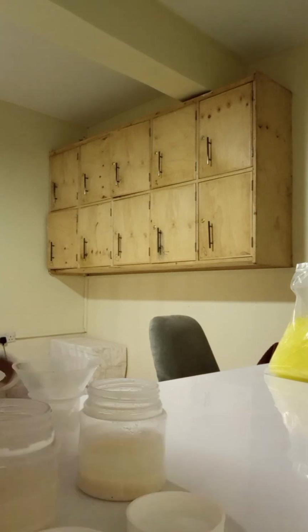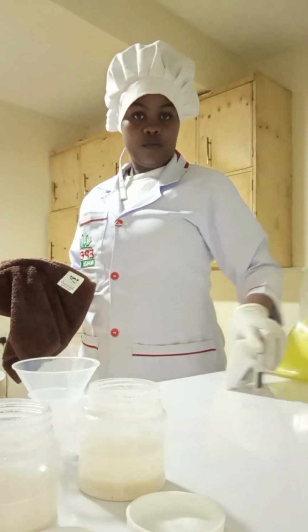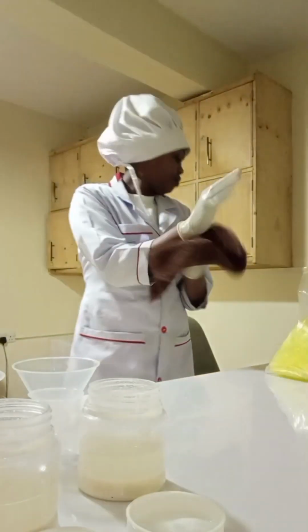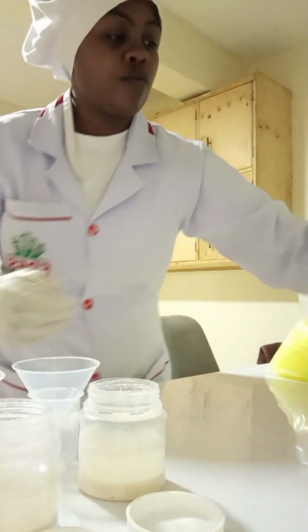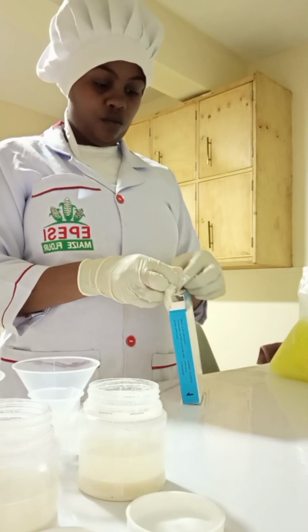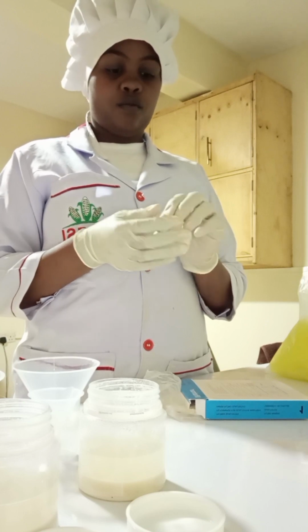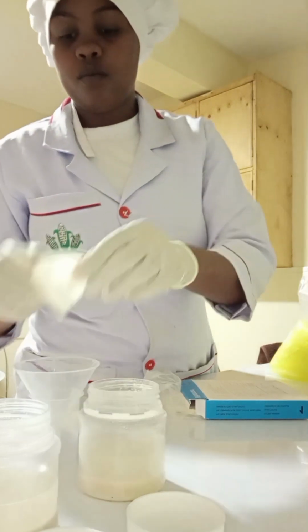You take the filtrate. The filtrate is the one that you're going to use, and in this process we always clean our hands. I don't know if others do that, but it's recommended to always clean your hands each and every time to avoid contamination. This test is so easy to contaminate, so you must ensure that your hands are always clean.